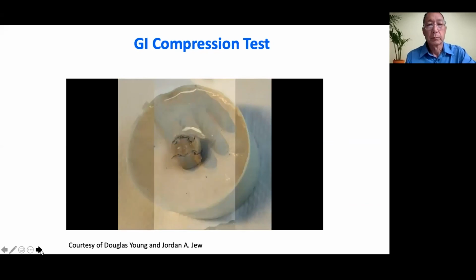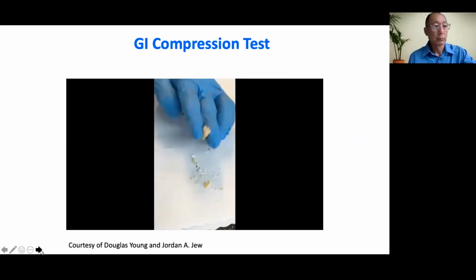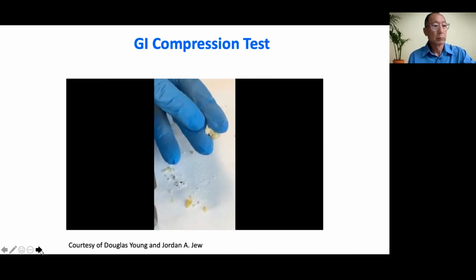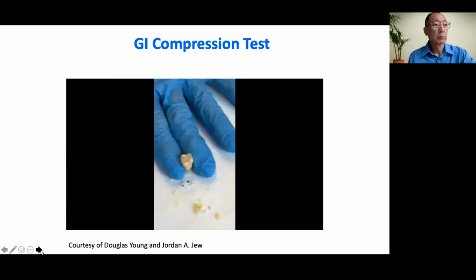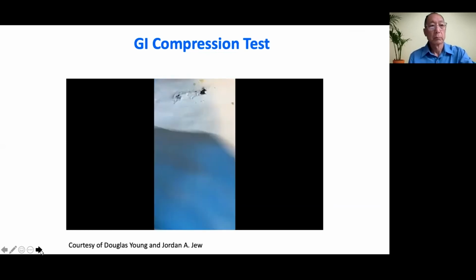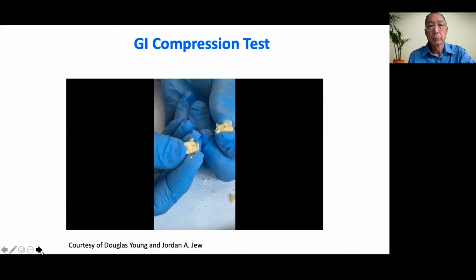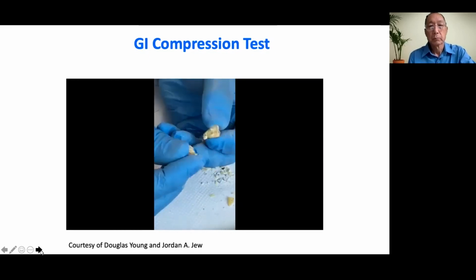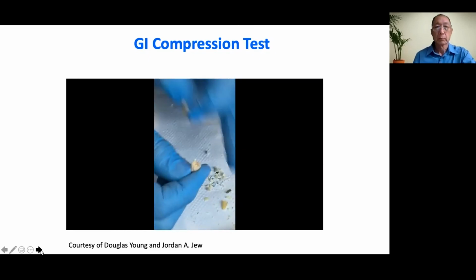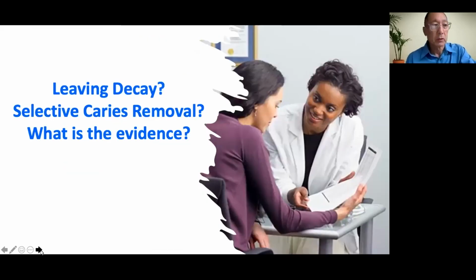And let's see what happens. That's about as hard as I would hit a small nail. The bottom of the root is shattering. And there we go. Again, we have the tooth splitting in half, but the glass ionomer is still in the tooth. So if you believe that it doesn't hold up to occlusal forces, I don't think anybody chews as hard as a hammer.